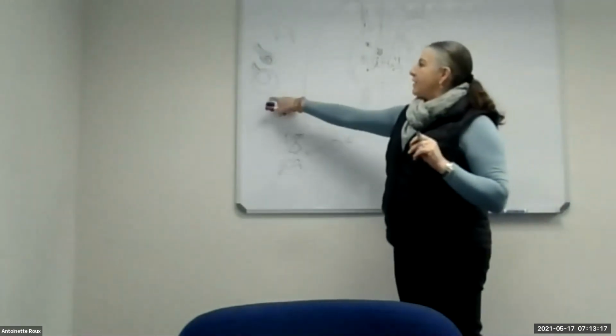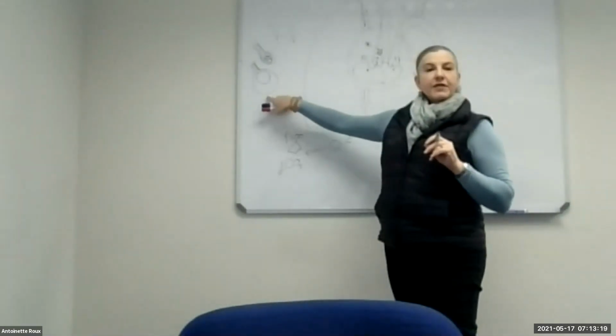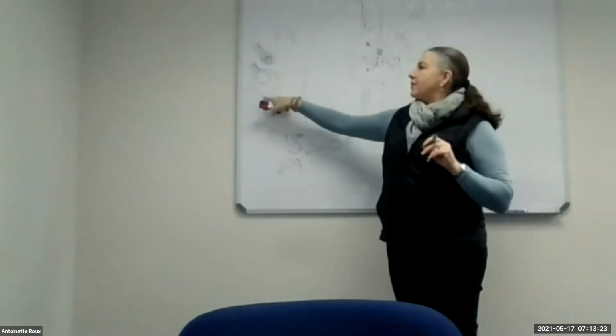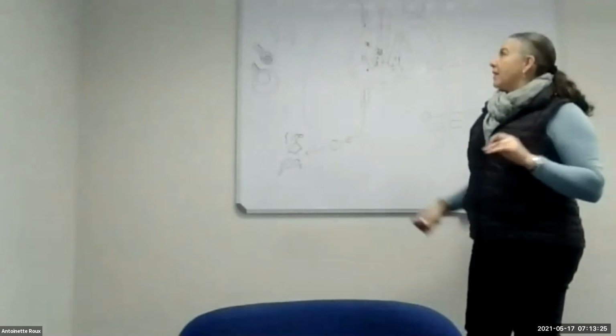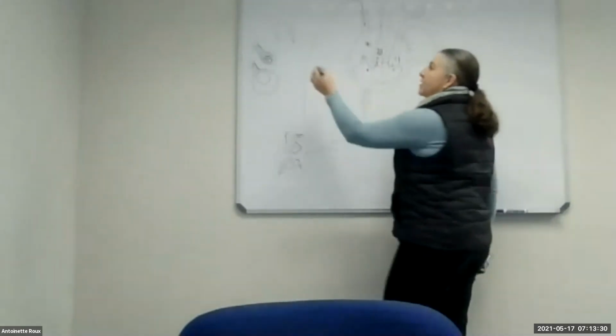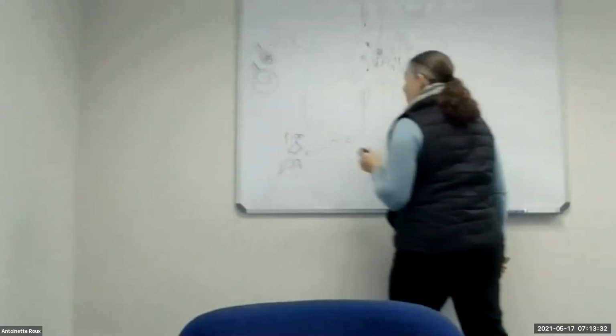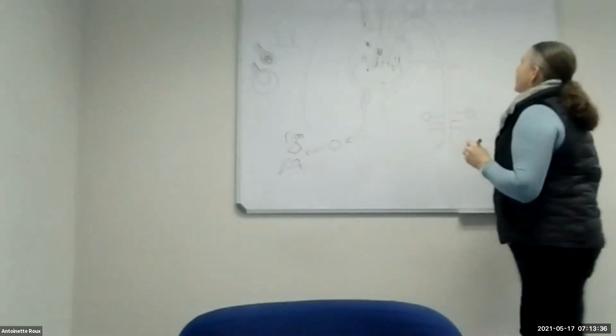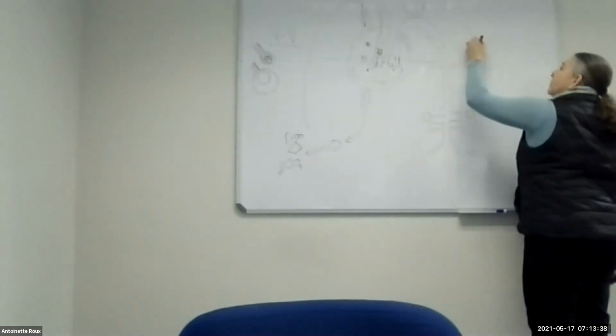So this will give you an indication of the amount of third space fluid that you have to get rid of in order for diffusion to take place properly into the capillary. So those are the two things that can be wrong in your lungs when you put the patient on VV ECMO. So we drain from a vein, return to a vein. Then we've got another modality. It's called VA ECMO.